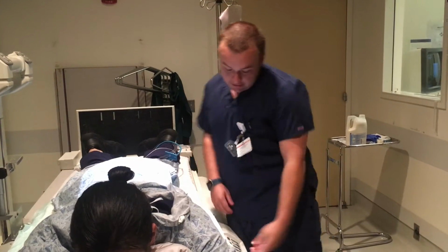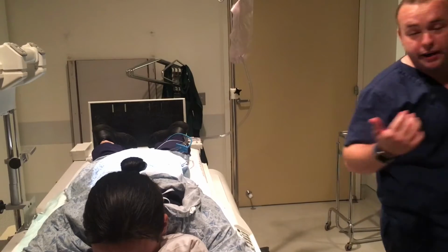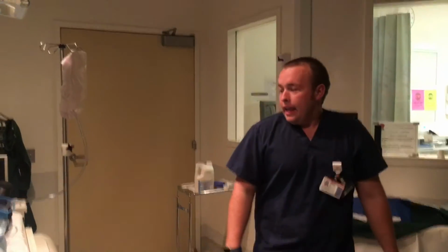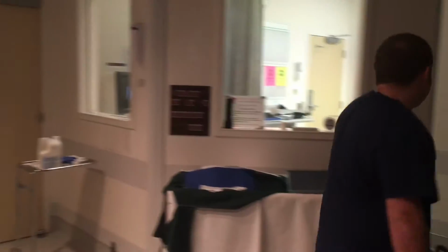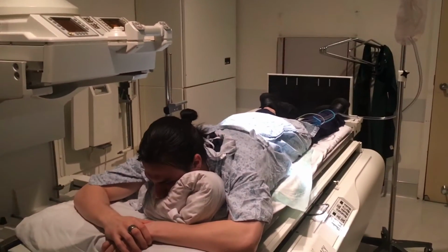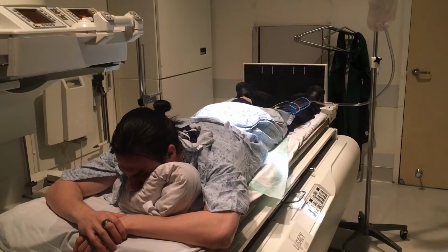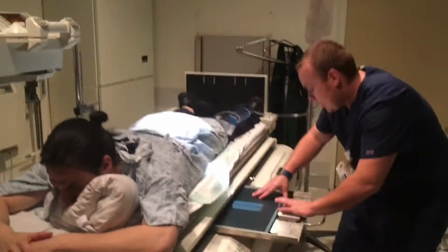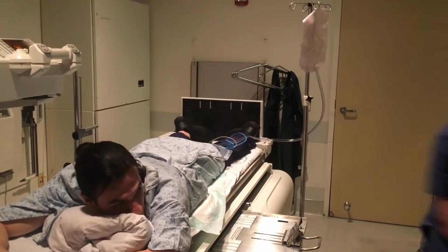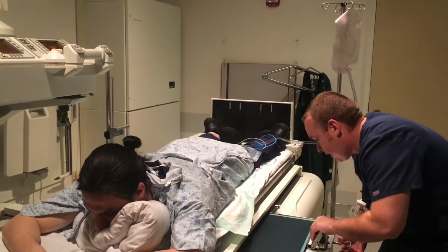Double check, lined up, and we're good. First picture is barium in there. I'm going to up my kVp from 80 to 85, and we're going to go 65 mAs. Alright, Jared, take a deep breath, blow it out, hold, X-ray, breathe. Alright, so we're going to scan this one. Thank you.